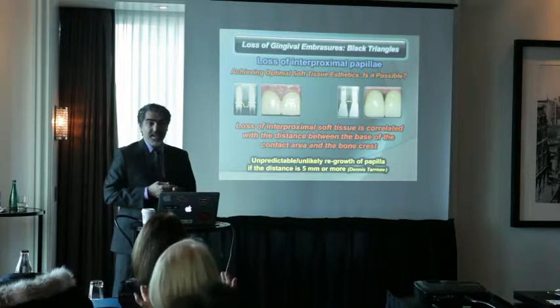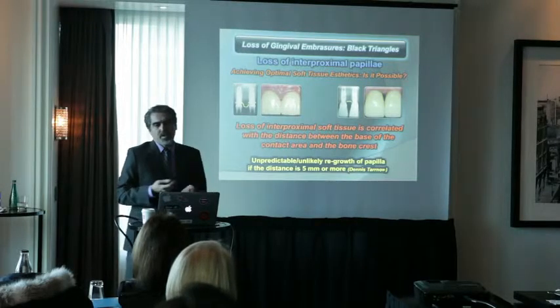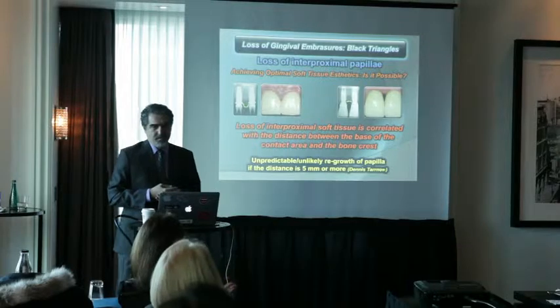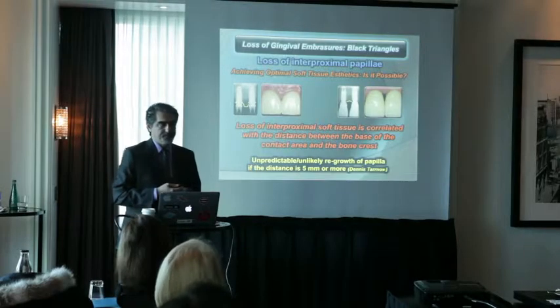That's actually, I think it does give some support to cantilever forming. You're not counting on that, especially with implants. You're not counting on that at all. Strictly for cosmetic reasons, plus that's for the biological reason, not for the mechanical reasons.